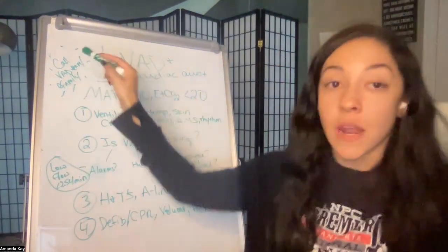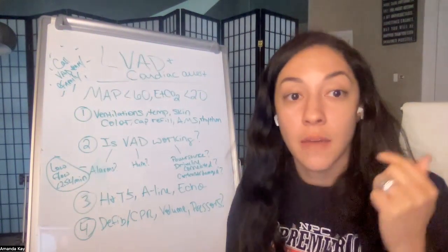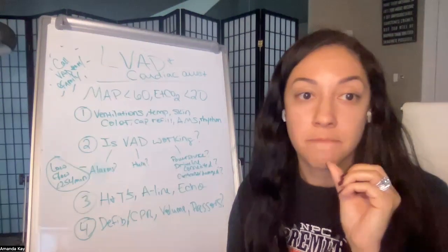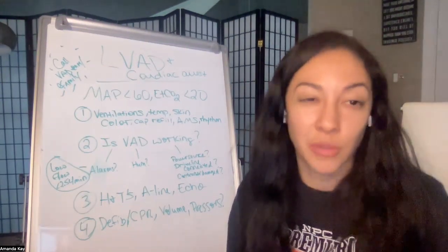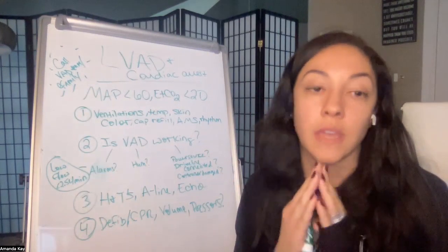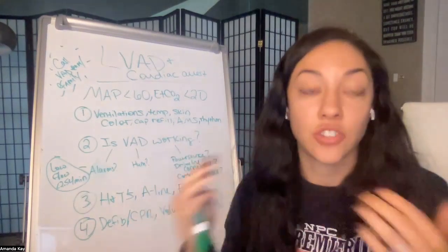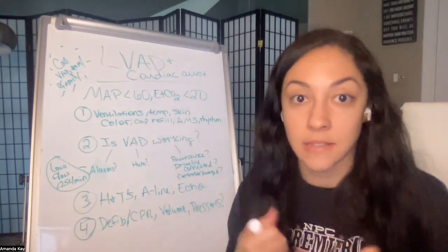All right. So number one thing is as soon as they get there, get somebody to call the LVAD team. They should have a card. There should be someone in your area. Get the secretary on it. Someone needs to be calling, there's like a 24-hour 7 line. The family should have the card information. LVAD team, get that person on the phone immediately. And family is always going to be a good source of information because they had to go through a lot of education and stuff for this. So family, get on the phone with that LVAD coordinator ASAP.